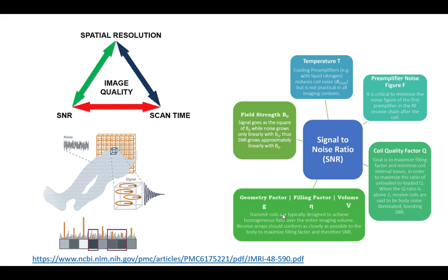Usually we do a lot of safety testing. We put them on animal standards long before, and there are times when animal testing is done. This is not really an animal testing situation. We allow the vets to have a higher field first, so that people doing veterinary work get a better quality image earlier, but then we can also make sure it doesn't hurt longer term.